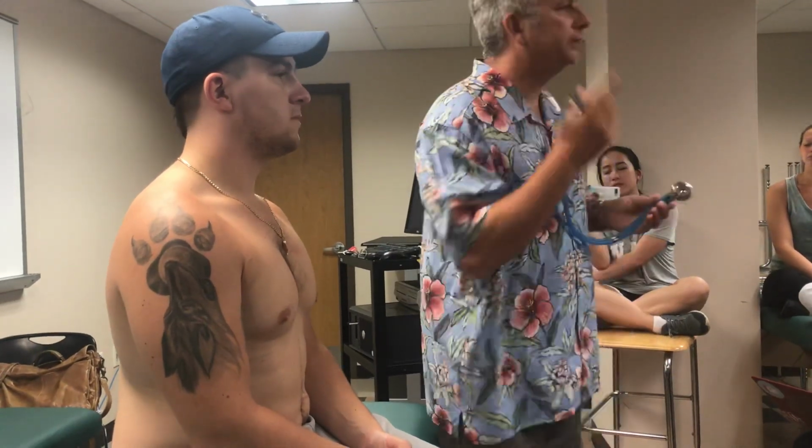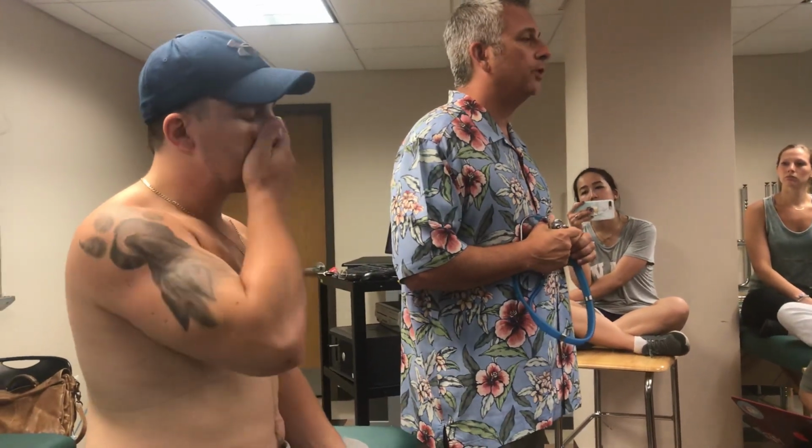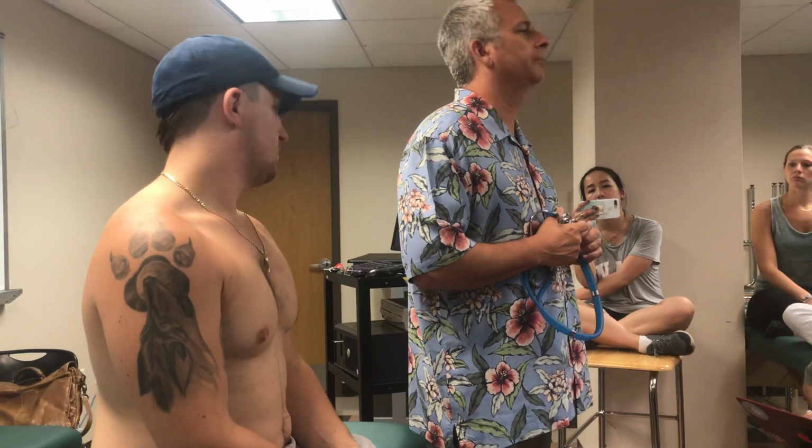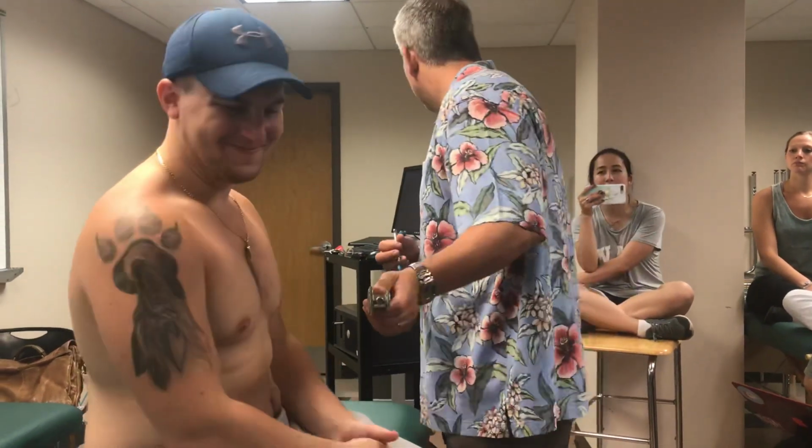When I'm auscultating the chest, I'll place my stethoscope there and try to listen for at least 1 to 2 respiratory cycles, sometimes longer. What you can't do is say, okay, take a deep breath in for me. Okay, do another one, because then they're going to pass out on you. So maybe what you need to do is place your stethoscope, do 1 or 2 cycles, take your stethoscope off, and let them breathe a couple of regular breaths. And then again, when they're taking deep breaths, it's not a good idea that your face is in front of them. So either you turn your head away.